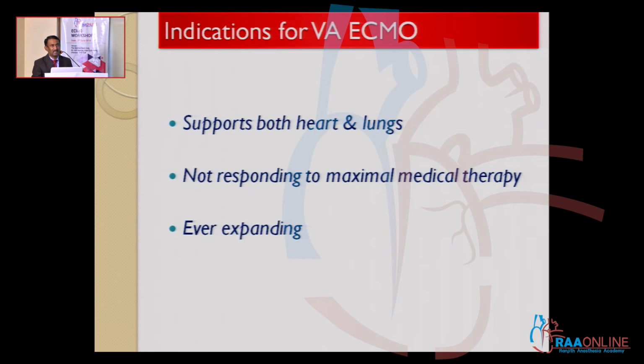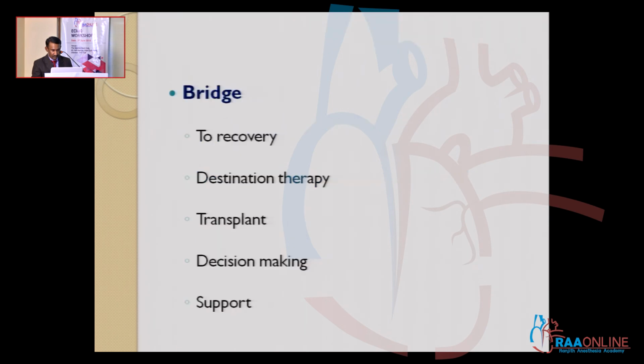And as we see the indications, if you look at the literature, there are a lot of articles and a lot of guidelines, but the indications keep expanding. If you look 5 or 10 years back, there were indications for which ECMO was not indicated, but right now we are using ECMO for those reasons. So we use a VA ECMO, or an ECMO, mostly like a bridge. It can be used as a bridge for some specific purposes. One is a bridge to recovery.